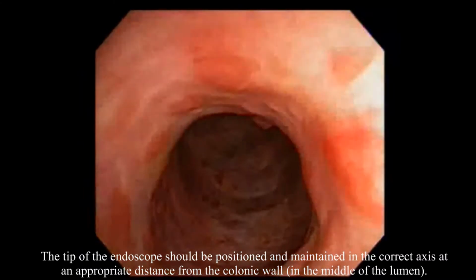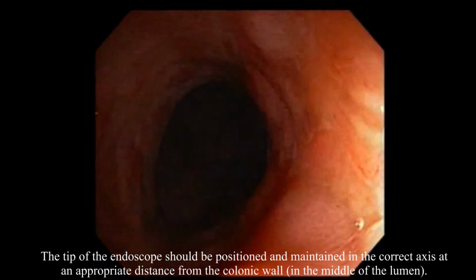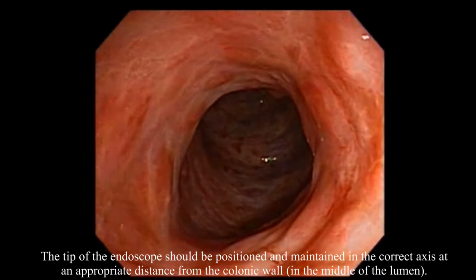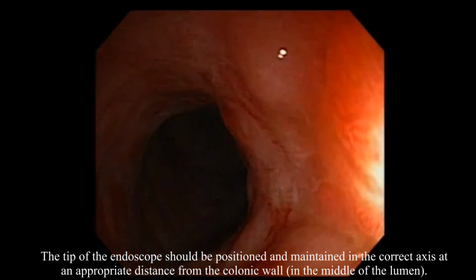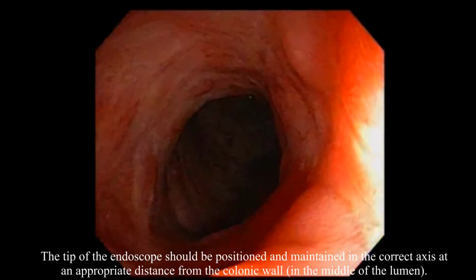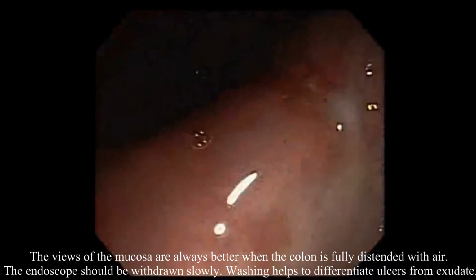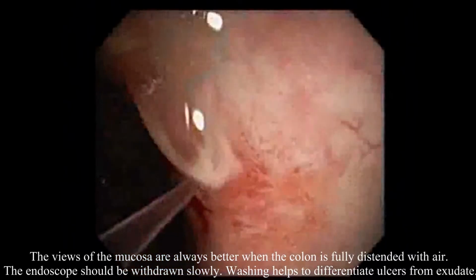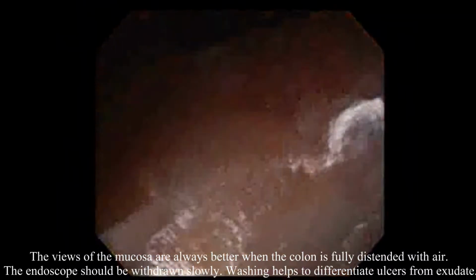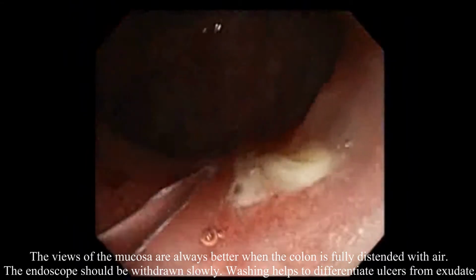The tip of the endoscope should be positioned and maintained in the correct axis at an appropriate distance from the colonic wall, in the middle of the lumen. The views of the mucosa are always better when the colon is fully distended with air. The endoscope should be withdrawn slowly. Washing helps to differentiate ulcers from exudate.